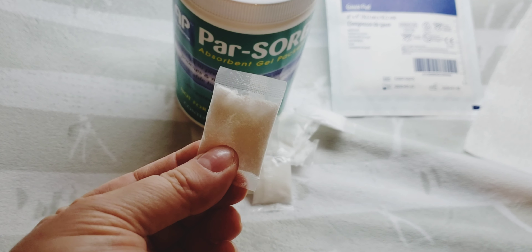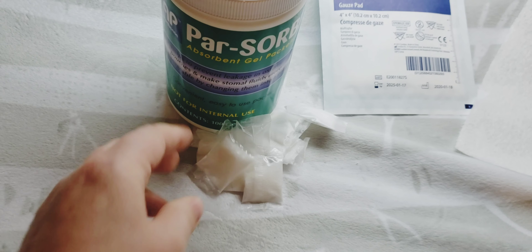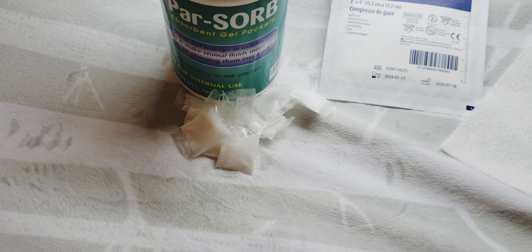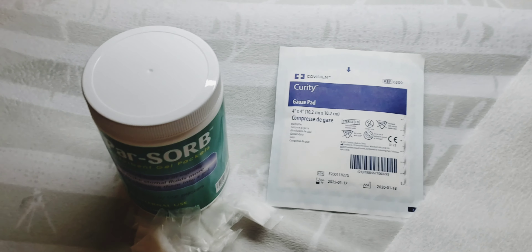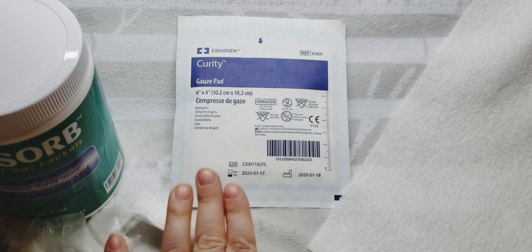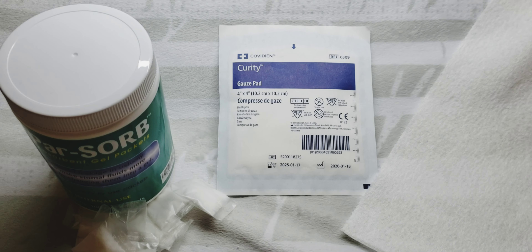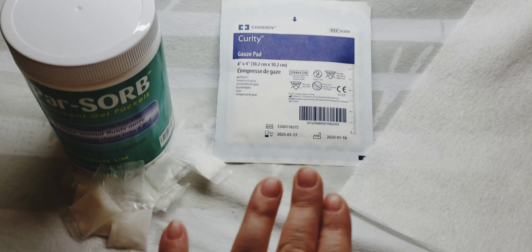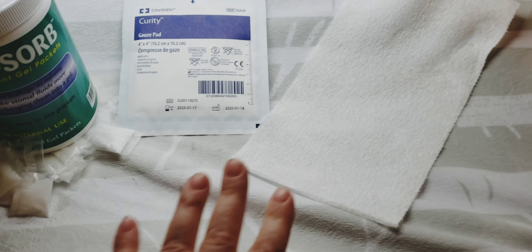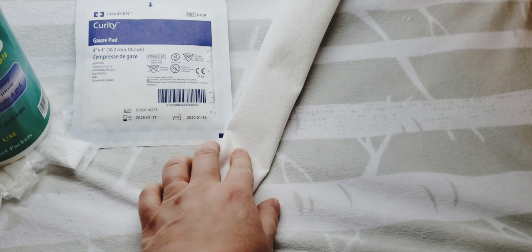It soaks it up and then it doesn't leak as bad because you've got like this glob in there. The other thing I have used many times are gauze pads, because they will send you a ton of them. I use Byram — whoever your supplier is will send you a bunch of these, and you get this from your supplier as well. And then if I didn't have anything around, I would roll a paper towel and stuff it inside.